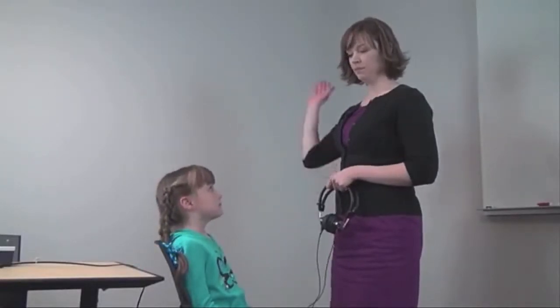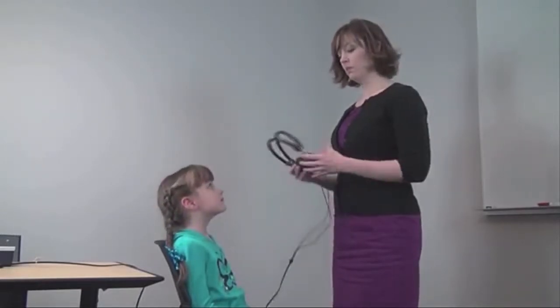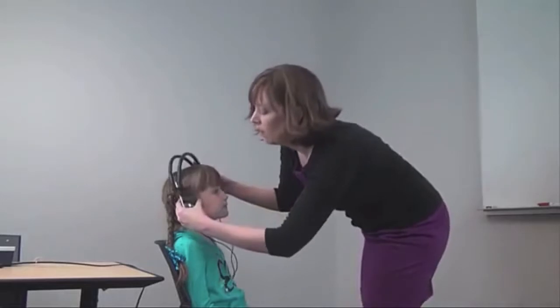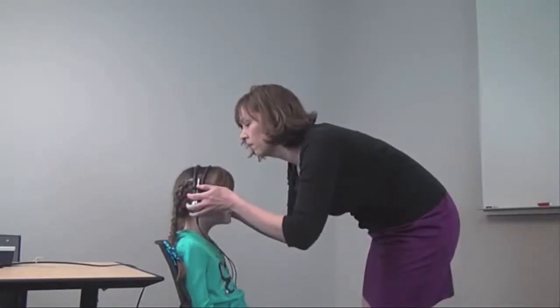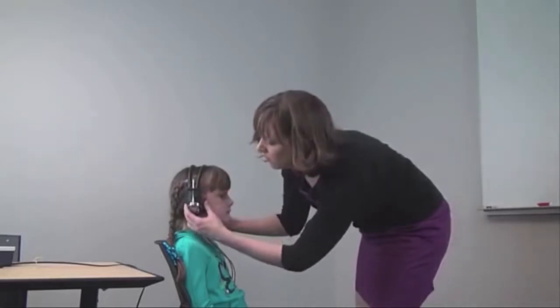Give the child instructions, such as, "You are going to hear some beeping sounds. Raise your hand as soon as you hear the sounds, even if they are very soft." Place the headphones on the child with the red phone on the child's right ear and the blue phone on the child's left ear, making sure that the headband is snug on the child's head.